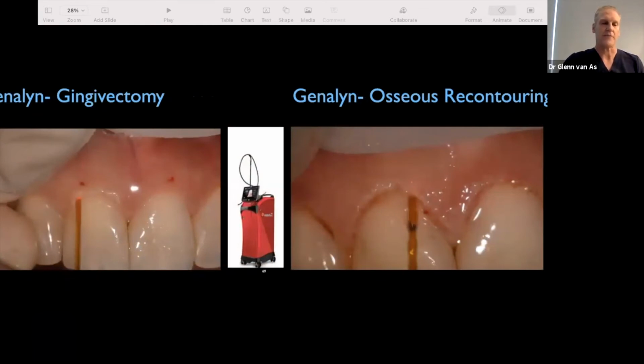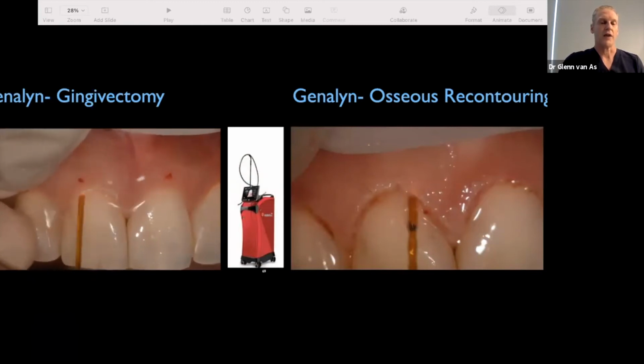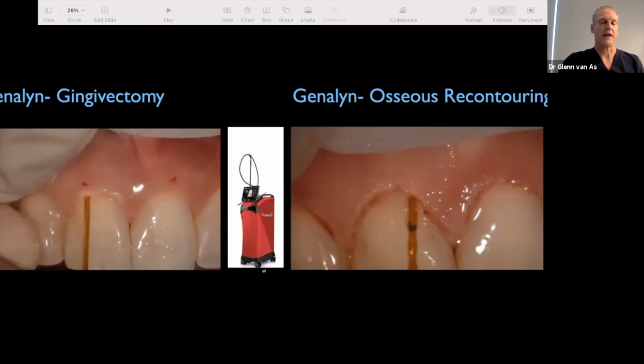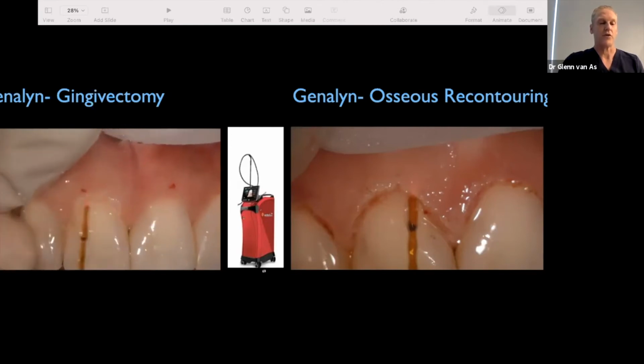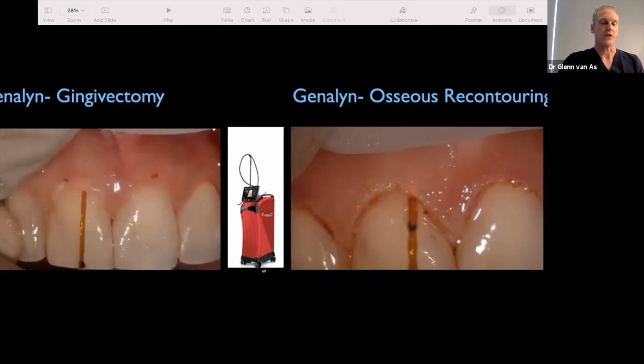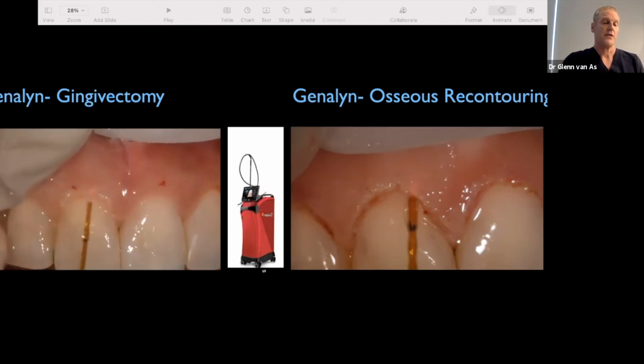And when you do this, it's 2 steps. The first part on the left is the gingivectomy portion, where I've put a little red dot with a periodontal probe as to where I would like to lengthen the tissue to. So I'm doing a gingivectomy parallel to the long axis of the tooth. And you can see I'm using, this is not a diode, this is an all-tissue laser, because after I do the gingivectomy, I'm going to recreate the biologic width, which was measured to be about 2.5 millimeters in her case. So once we've created an improved appearance, if we just left it like this with a diode laser, it would all spring back. She didn't want any restorations. We're just doing a crown lengthening in her case.